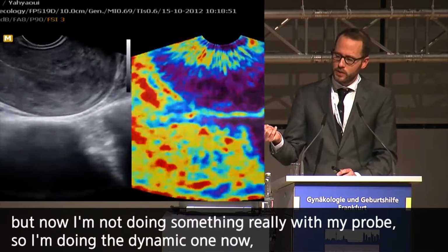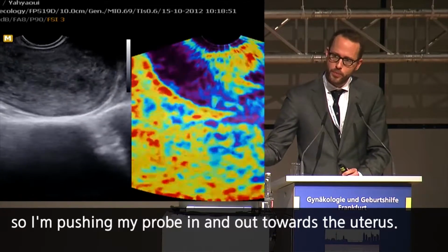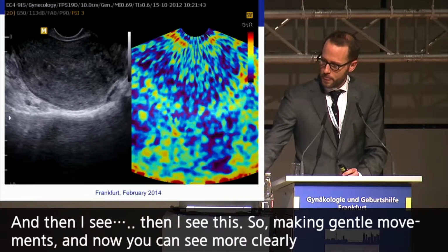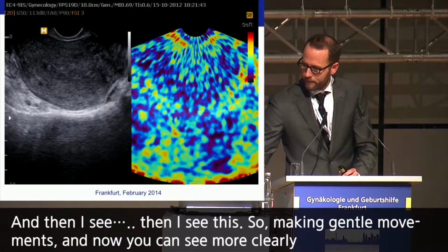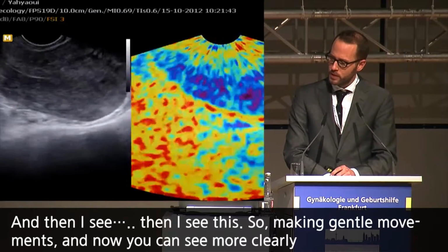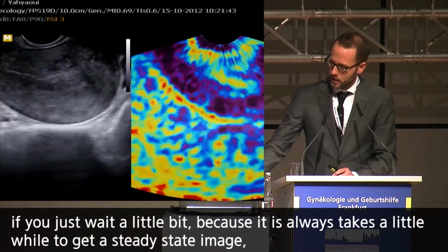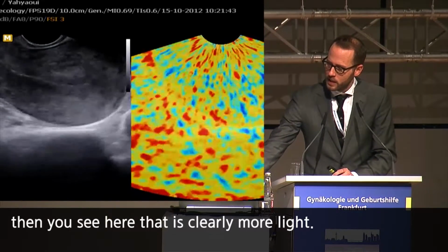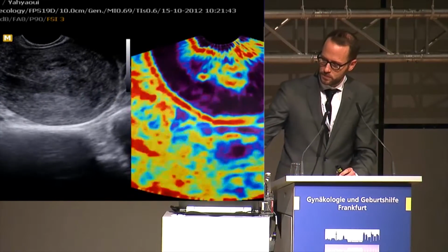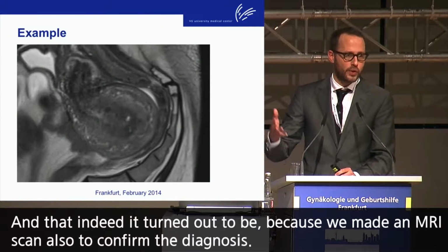But now I'm not doing something really with my probe. So I'm doing the dynamic one now, pushing my probe in and out towards the uterus. And then I see this. So making gentle movements, and now you can see more clearly if you just wait a little bit, because it always takes a little while to get a steady state image. Then you see here that it's clearly more light, and that's indicative for adenomyosis. And that indeed it turned out to be, because we made an MRI scan also to confirm the diagnosis.